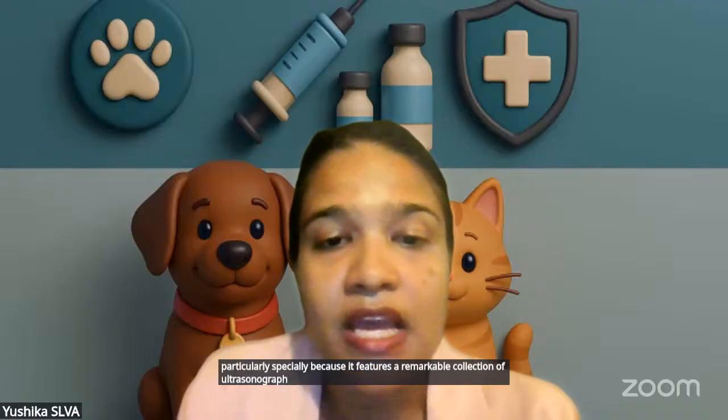Tonight's session, Mastering the Ultrasound, a Systemic Approach, is particularly special because it features a remarkable collection of ultrasonographic images captured directly from Dr. Mathota's own clinical practice. This offers us a rare practical look at diagnostic excellence in an everyday setting.